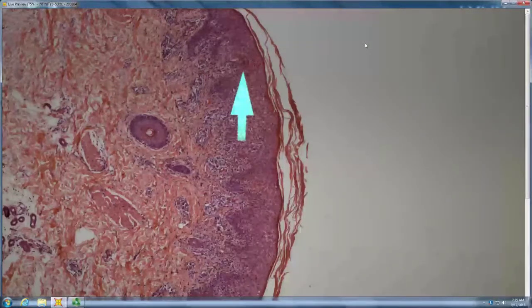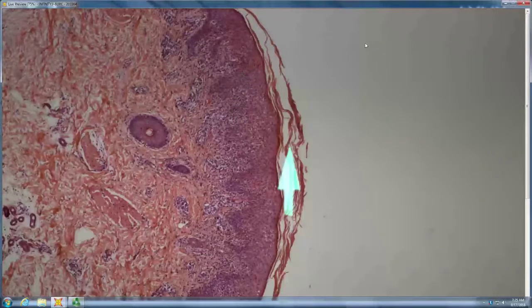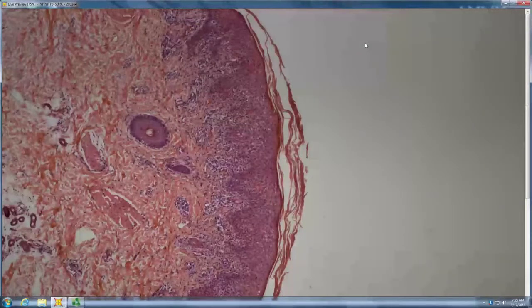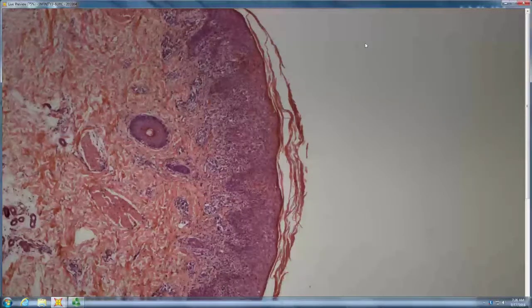There's PLEVA and PLC. And do you see a real dirty scale crust? Yeah, I'd say not so much. PLEVA usually has a thick, dirty-looking neutrophilic scale crust and a dense, superficial and deep infiltrate. This is pretty much superficial, no big, thick, dirty scale crust. So, PLC. Okay. And in sign-out, we just tend to say pityriasis lichenoides and not worry about acute or chronic because there's actually a lot of overlap.